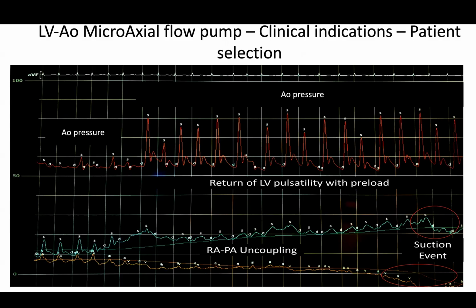Excellent. So yeah, that's the case. If you think about it, you're the operator, you get an LAD that is occluded and someone who is in shock. Probably you'll do what type of device, without looking at this? RV support. No, without looking at this. Yeah, you'll put in an Impella CP, right? So what would happen if that's the case? We don't have anything for that kind of forward pressure. Everything's kind of back loading. So you'll get what type of alarms? Suction alarms, suction alarms, suction alarms.